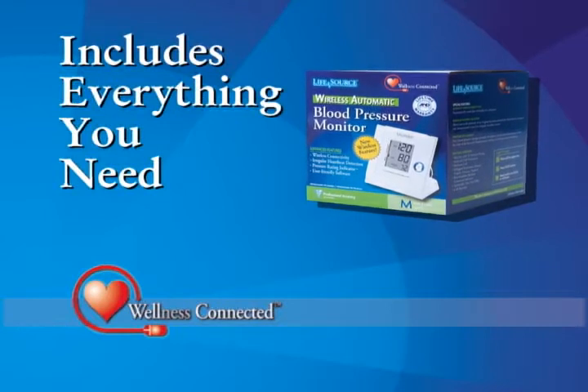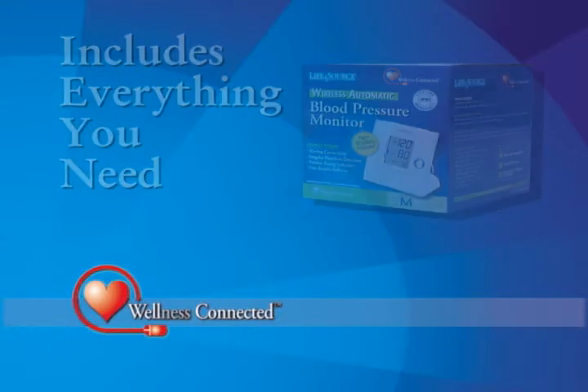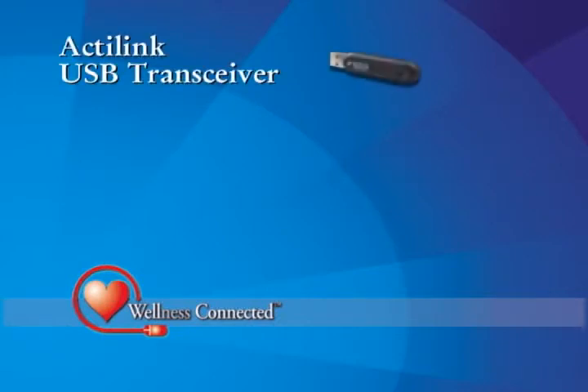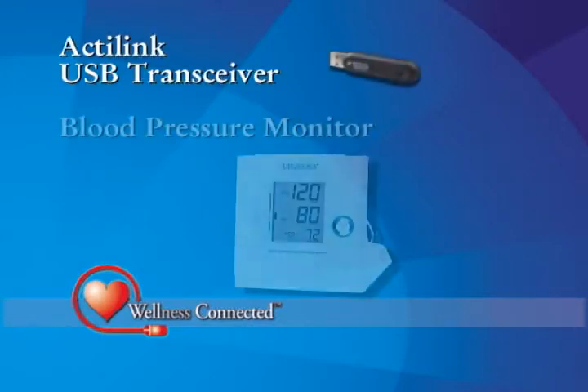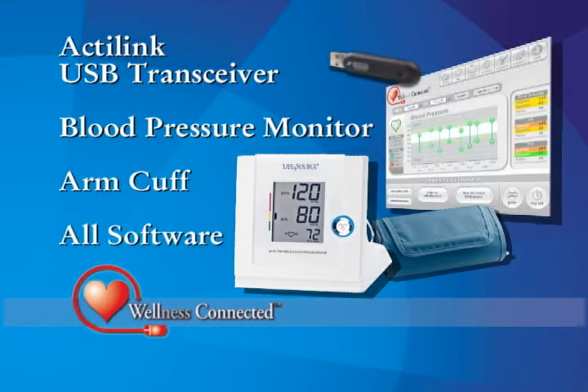The Wellness Connected Wireless Automatic Blood Pressure Monitor comes with everything you need to get up and running in minutes. You'll get the unique ActiLink USB transceiver, the blood pressure monitor, adjustable arm cuff, and all of the software you need to get up and running quickly and easily.